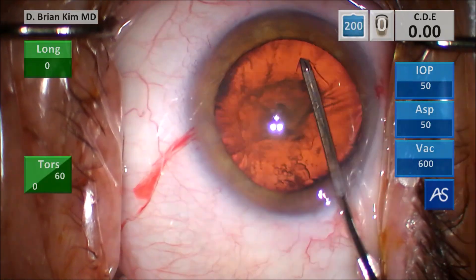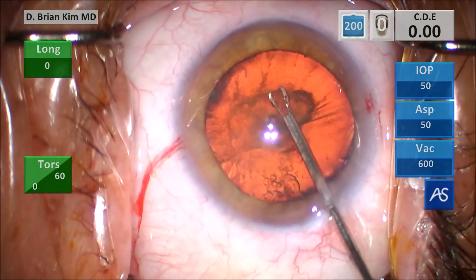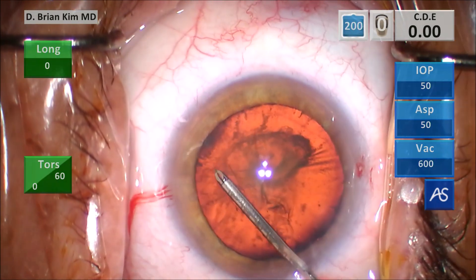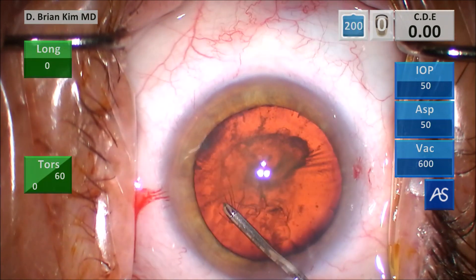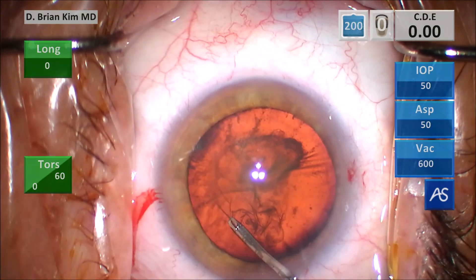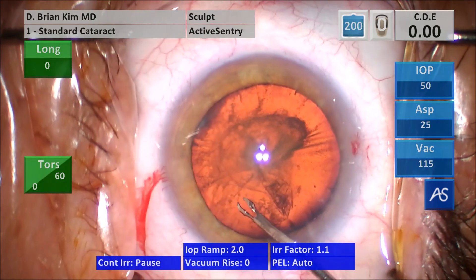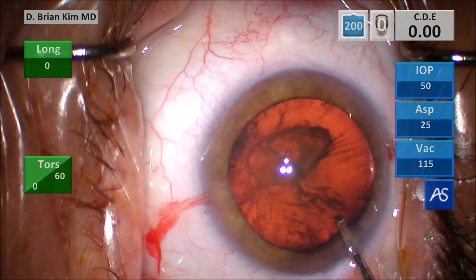I go ahead and puncture the center, pull down, grab the right side of the tear, and go around circumferentially. The rhexis goes rather uneventfully. In these cases it's very important to make a rhexis just the right size — not too small so it's difficult to disassemble the lens, and not too big in case you have to place a capsule tension ring or capsule tension segment. You want to have adequate anterior capsule support.